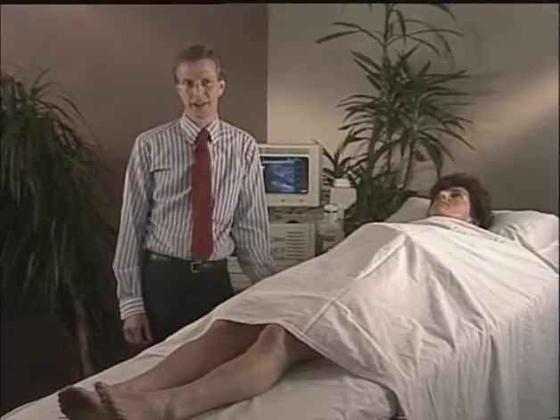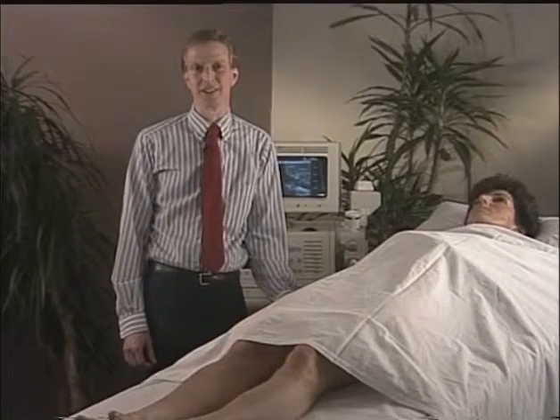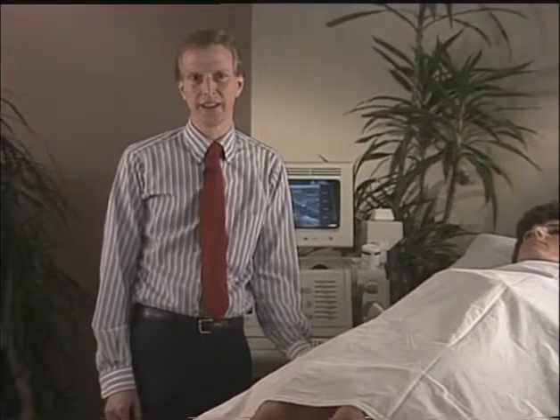Welcome to this instructional videotape on successful Venus imaging. I'll be walking you through the Venus imaging examination step by step. During the past few years, the art of Venus imaging has been fine-tuned to include the entire Venus circuit. Its accuracy has been proven in study after study to rival that of contrast venography. Venus imaging is becoming the standard diagnostic examination for detection of Venus thrombosis.